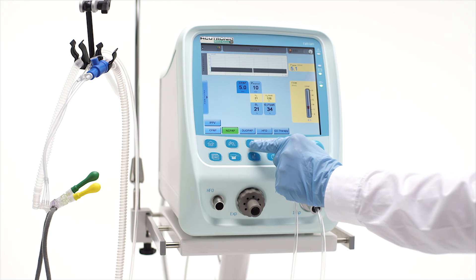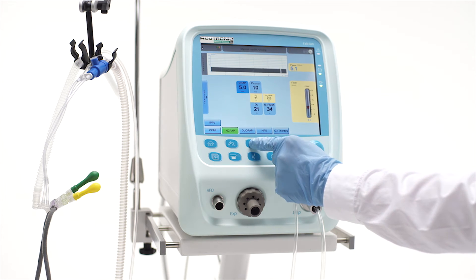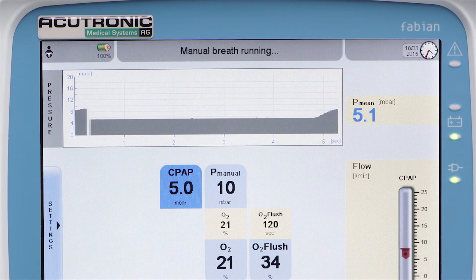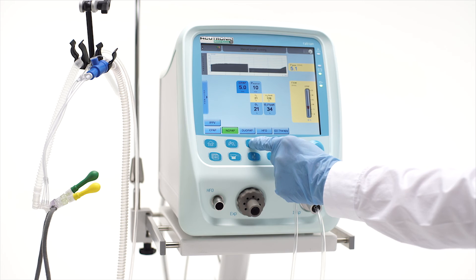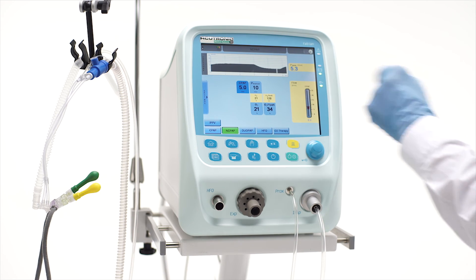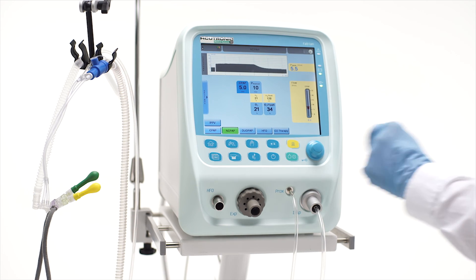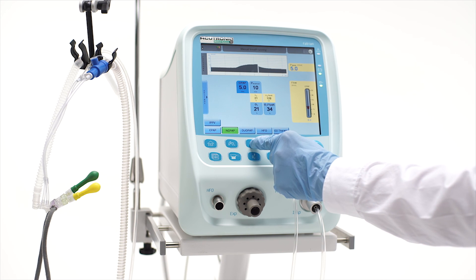The P manual button allows you to set the desired pressure level during a manual inflation to the patient in case of apnea or a lung recruitment maneuver. The O2 and O2 flush may be regulated accordingly.